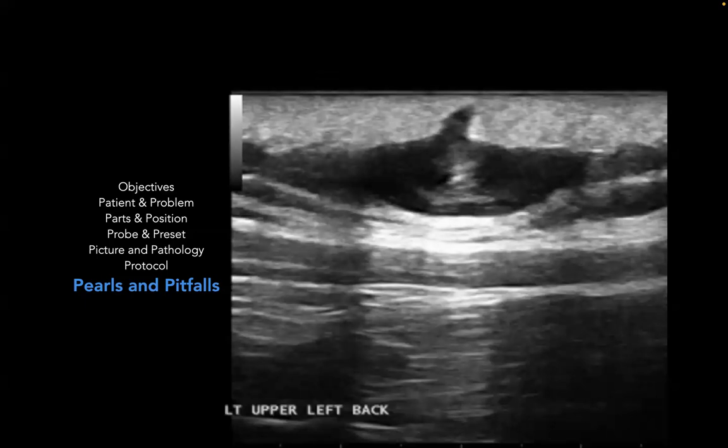Here is an epidermoid cyst. This is an epidermoid cyst because it has a nice cystic appearance. Cysts usually look black, and it's well circumscribed. Sometimes it can have some echogenic material inside. And the hallmark of an epidermoid cyst is this central punctum. This punctum attaches to the epidermis. So if you can see it on exam, or if you can only see it sonographically, this can be an indication that this is an epidermoid cyst.